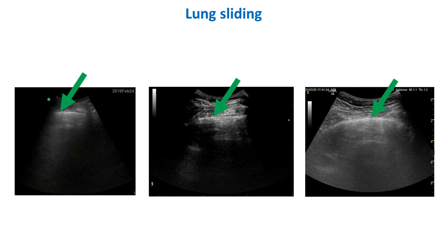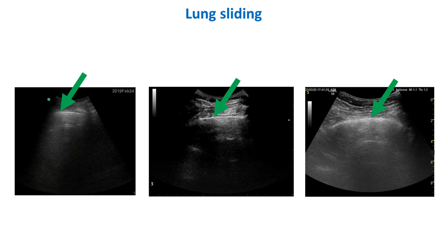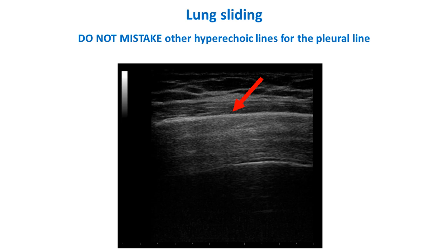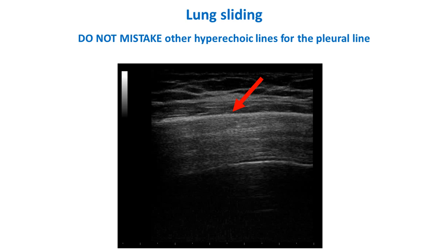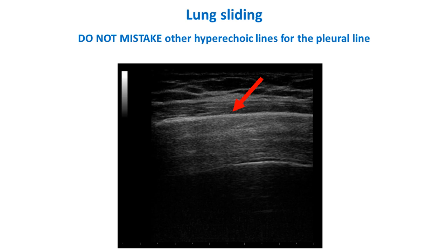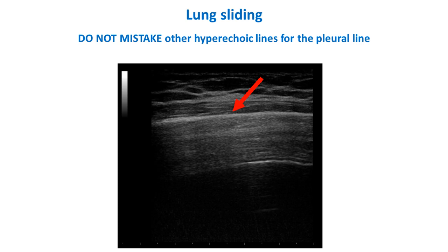The first step is to visualize the pleural line — this hyperechoic horizontal line indicated by the green arrows — and the lung sliding, the horizontal movement of the pleural line synchronous with respiration. It is important not to confuse the pleural line with other hyperechoic lines that are not the pleural line, as in this case where the red arrow indicates a hyperechoic horizontal line which does not move with respiration and thus is not the pleural line.